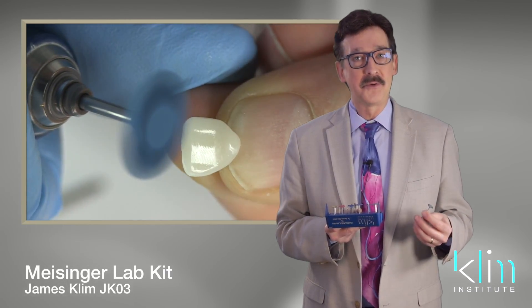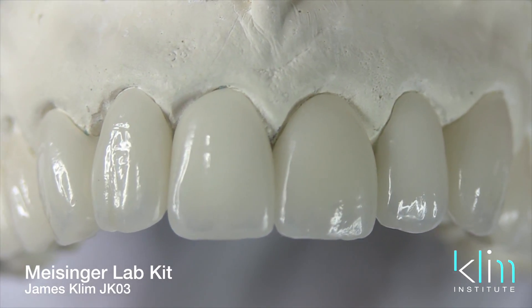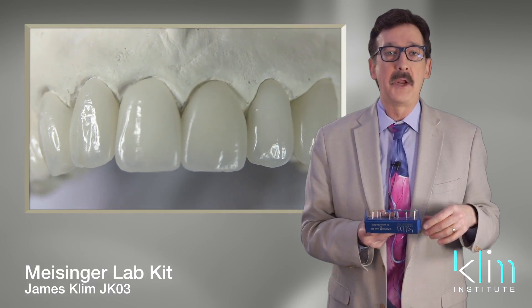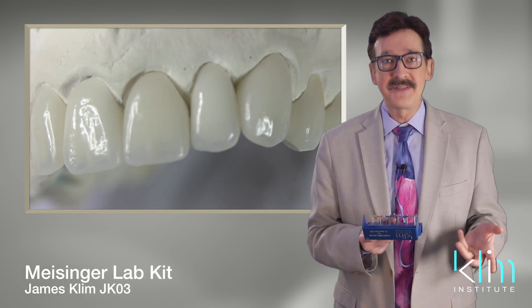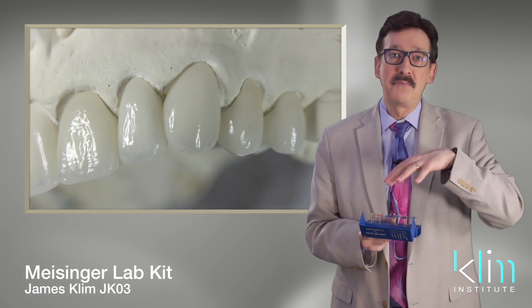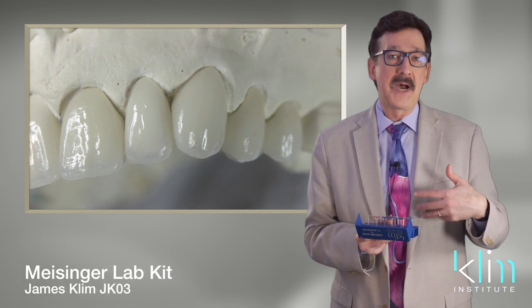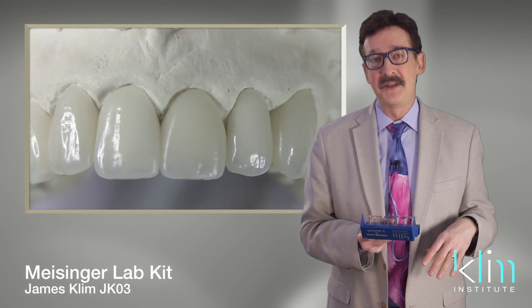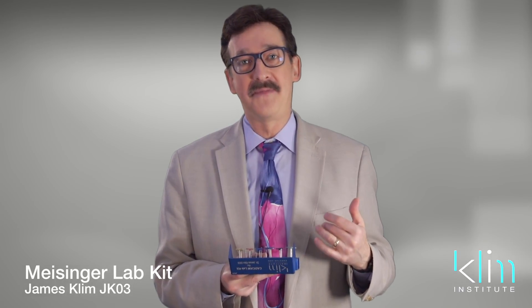Otherwise it's going to damage the twist. I like these twists for my final polishing of my ceramics, whether I glaze them or polish them. A great way to control vitality on your ceramics is controlling how the light bounces — that's where these twist polishers come in so handy. It allows you to polish your ceramic without losing the micro surface texture. You can highlight the smoother areas and tone down the concave areas. Now that I've learned how to use the twists, I've found them to be one of my favorites.